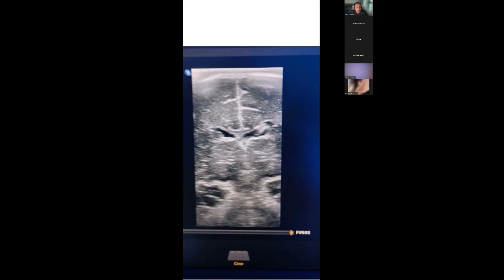I'm having the issue. The linear probe is the only probe available for me now because I moved to another hospital, so this is the only option for me. Do you have an abdominal probe? Yes, there is. You can use the abdominal probe as well.